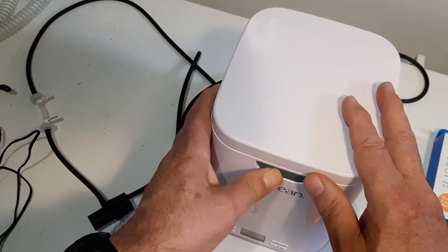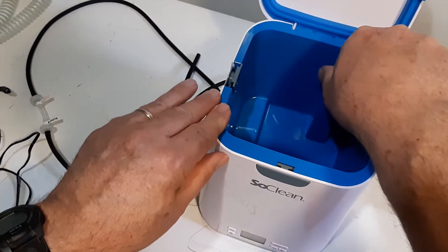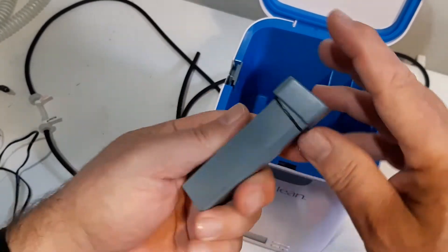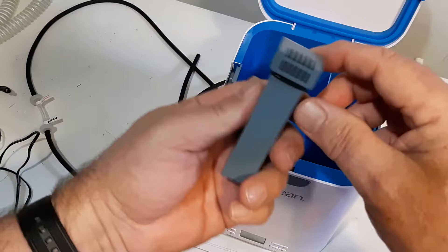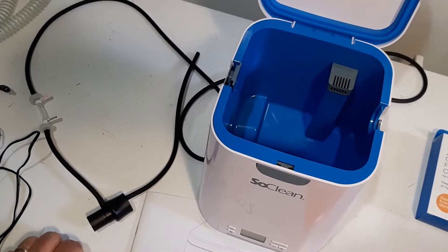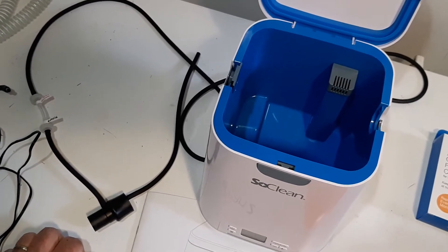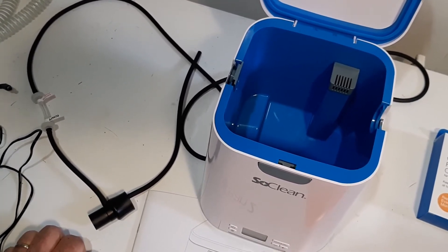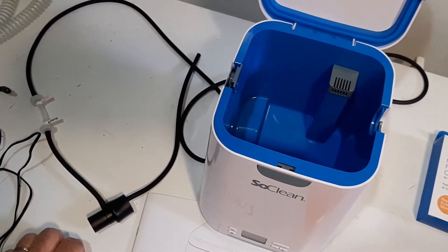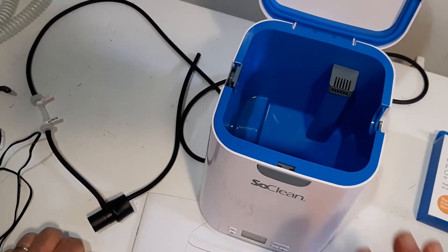One of the first things you look at — I'm going to push the button open here. Inside here there's what they call the filter. It only goes one way, and this filter has to be changed every six months. It can't go in the opposite way, it won't fit. Once you get the unit going, it makes O3 and it disinfects your mask, your hose, and even the distilled water inside the chamber of your CPAP machine.